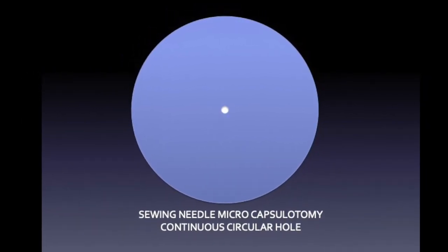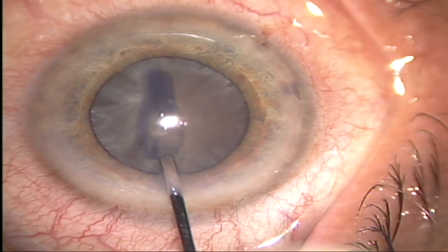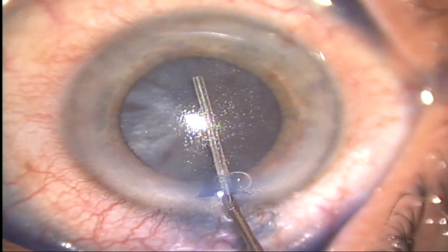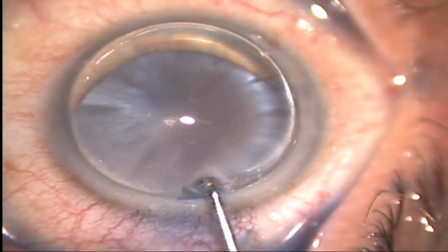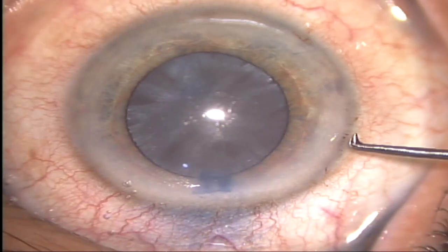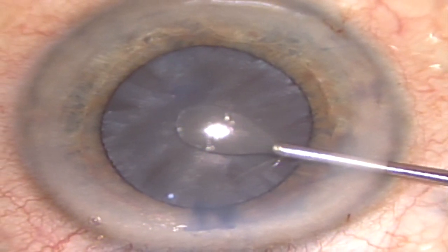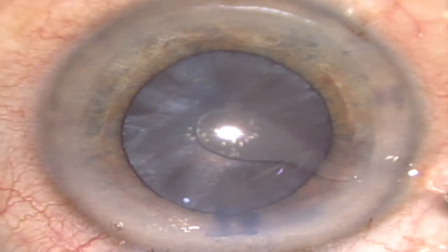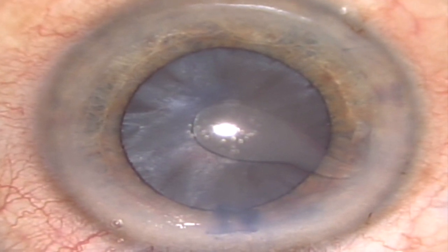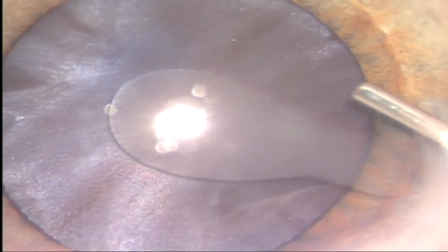We can also make multiple holes for better action. To achieve successful Microcapsulotomy, after routine incisions, the anterior capsule is stained with 0.06% trypan blue dye to enhance visibility. Ophthalmic viscoelastic device is injected to maintain a deep anterior chamber with appropriate pressure. Using the main or side port corneal incision, the Sewing Needle Microcapsulotome is inserted into the anterior chamber. The tip of the hook is placed vertically over the center of the anterior capsule, and under direct visualization, the tip is then directed posteriorly, perpendicular to the nuclear surface, to pierce through the stressed tight anterior capsule. Pressurized intralenticular fluid gushes out like a volcanic eruption through the hole, which decreases the intralenticular pressure and helps in decompression of the capsular bag.